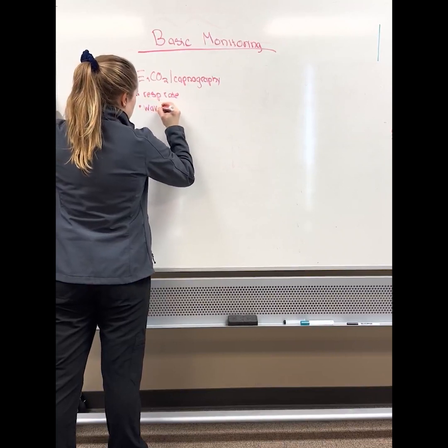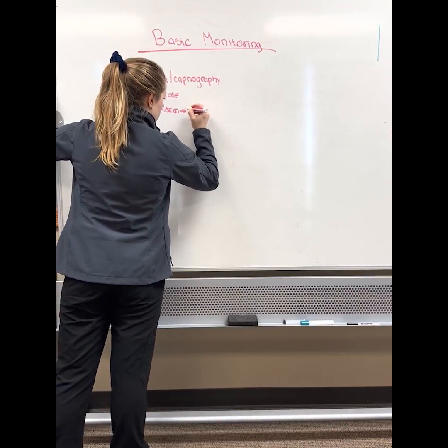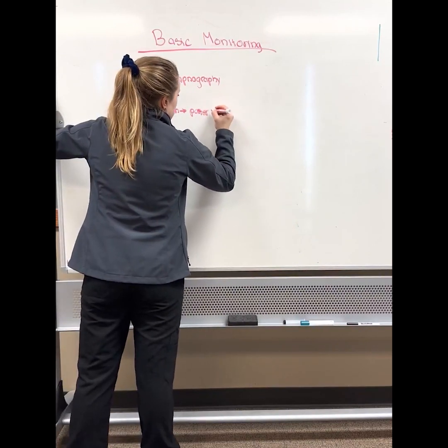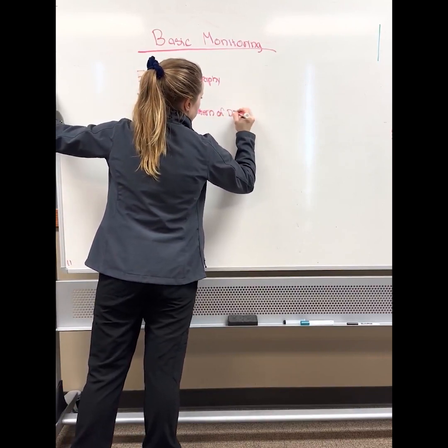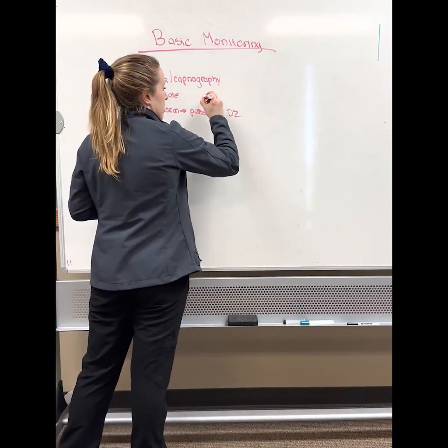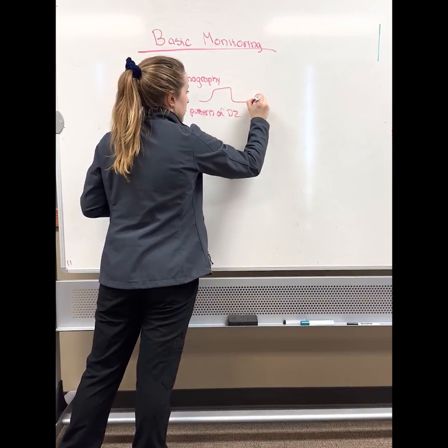And it gives you a waveform. And the waveform can be significant for certain diseases, pattern of disease. So capnography on the monitor usually looks like something like this.